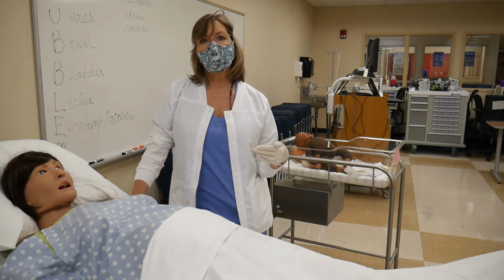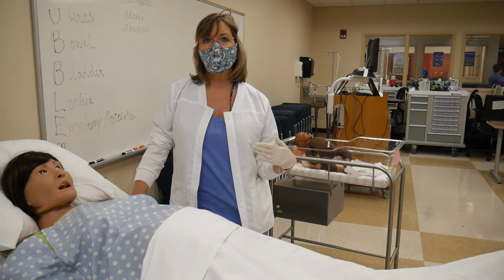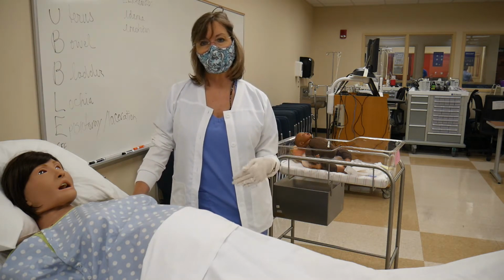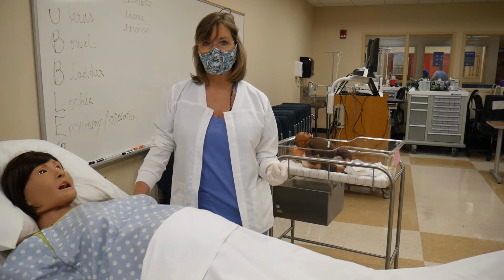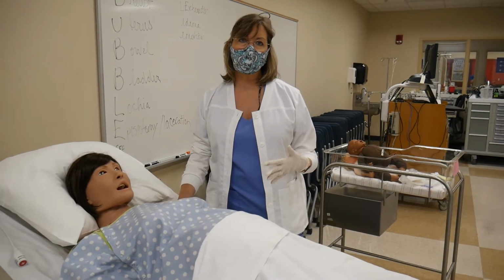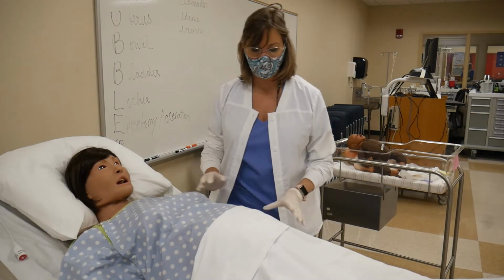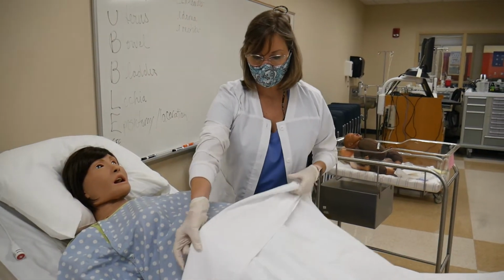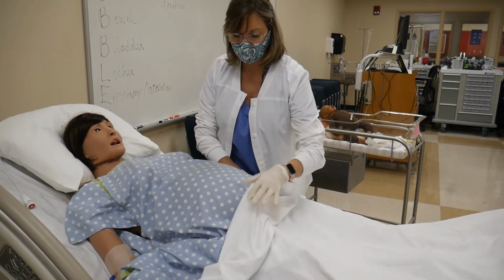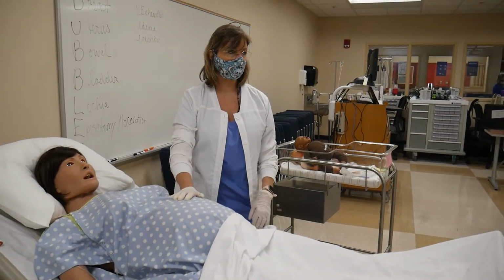If we don't have a lot of labor patients, sometimes students are assigned to triage, and that's where people come in, they think they're in labor, they think their water broke, they haven't been feeling the baby move, they need to get checked out, but they may or may not be in labor. So putting the fetal monitor on is something that students can do a lot, and it's not difficult once you know how. So we're going to talk about the monitor itself, but we're also going to talk about how you place that monitor.